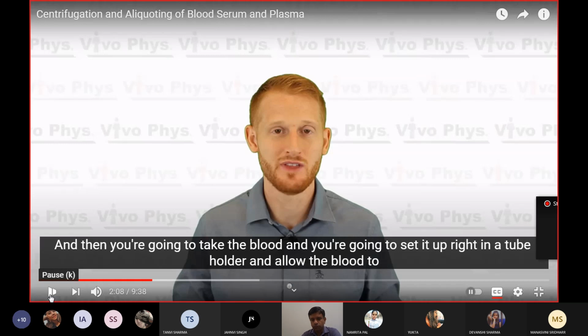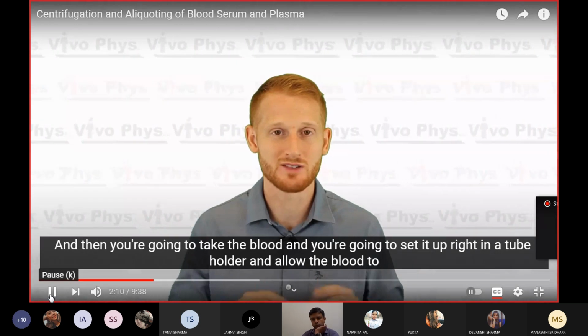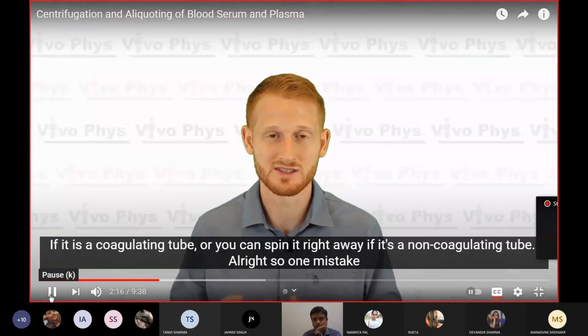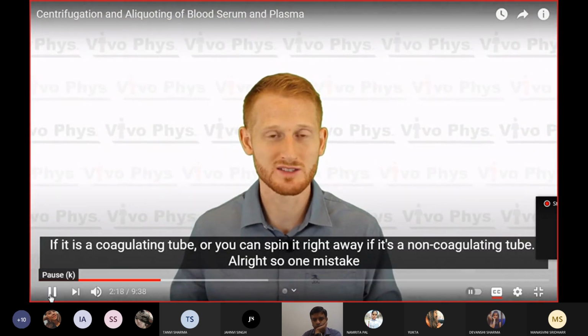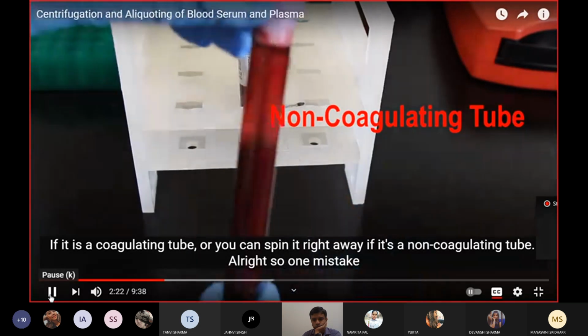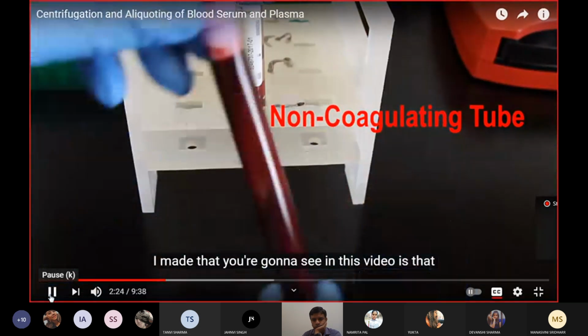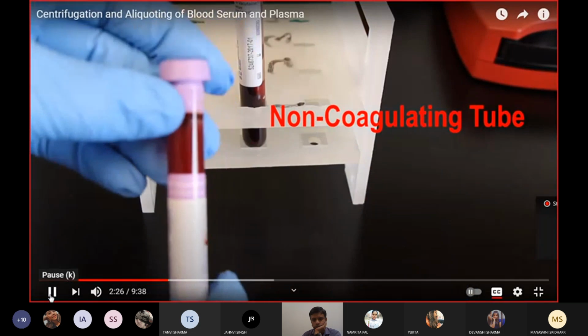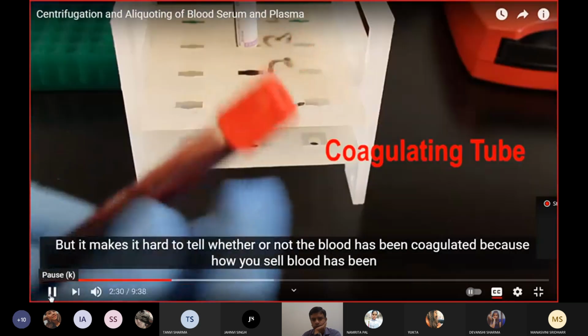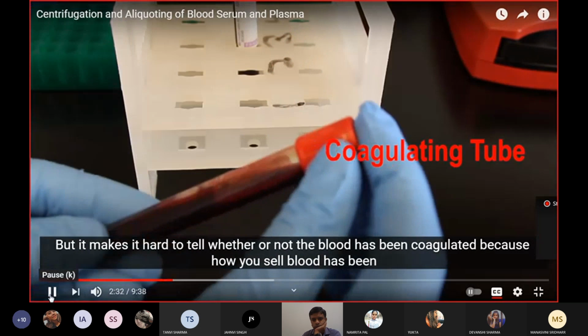Then you're going to take the blood and set it upright in a tube holder and allow the blood to clot if it is a coagulating tube, or you can spin it right away if it's a non-coagulating tube. All right, one mistake I made that you're going to see in this video is that I forgot to put them in a tube holder.